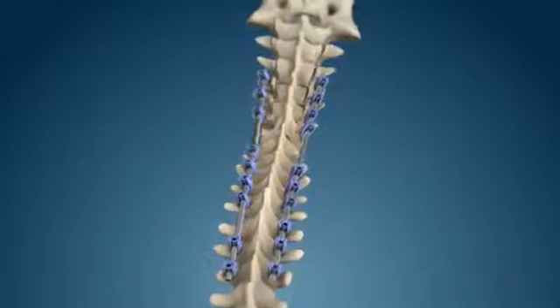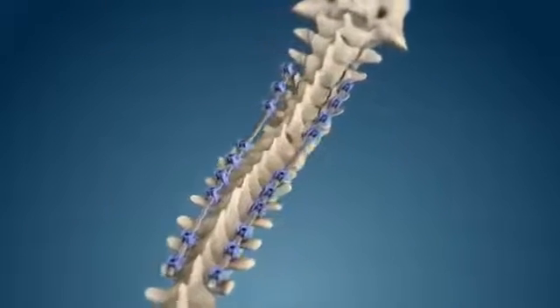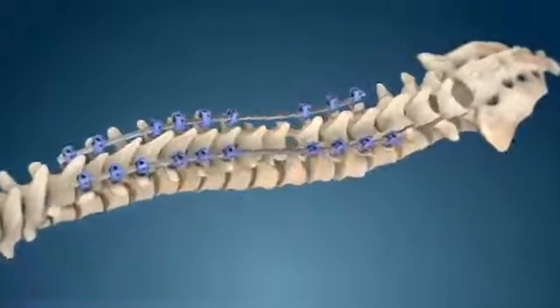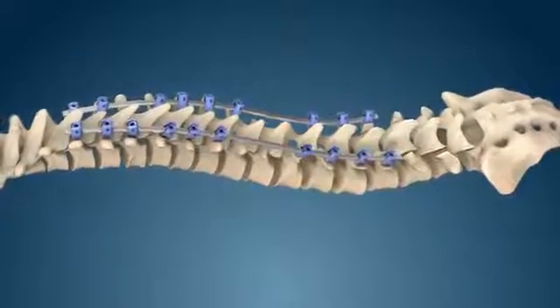All of the instruments are removed. The rod on the contralateral side is positioned and the derotation helical flange plugs inserted and tightened.